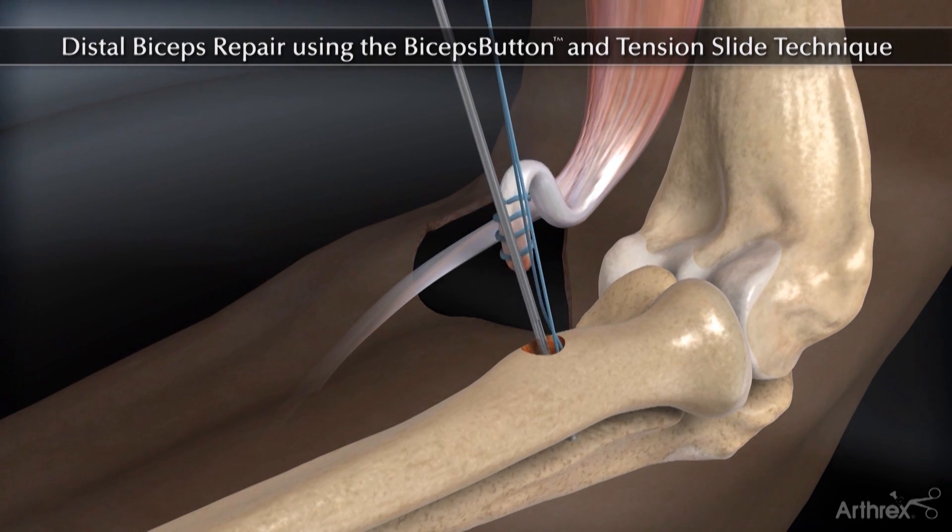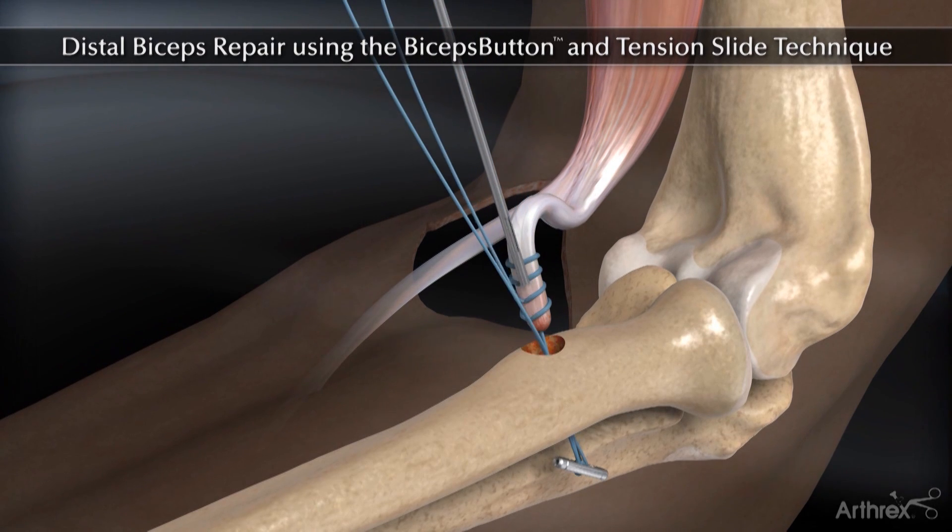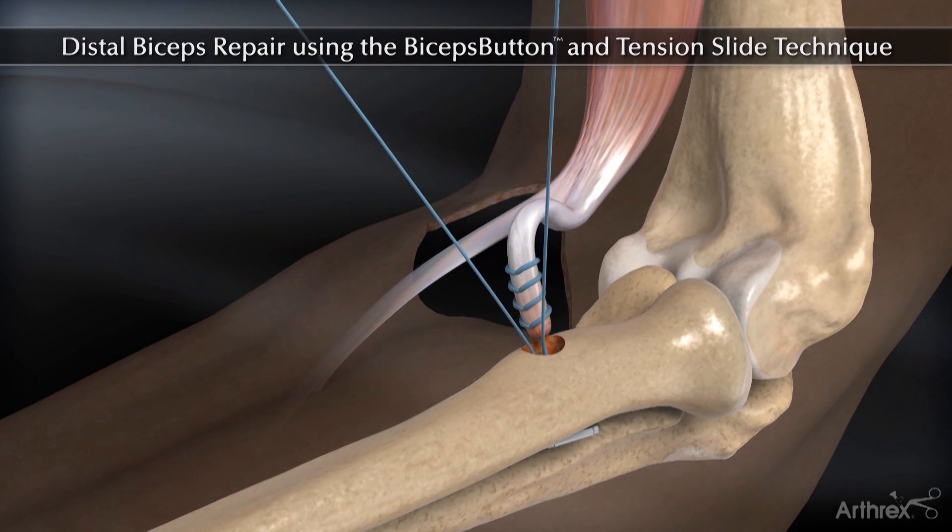Insert the biceps button through the far cortex. Flip the button and pull the suture limbs to dock the tendon into the tunnel.